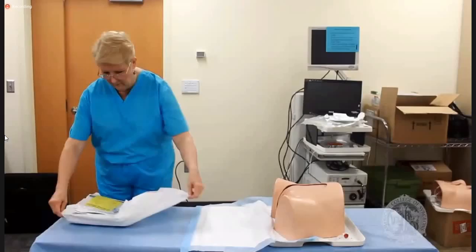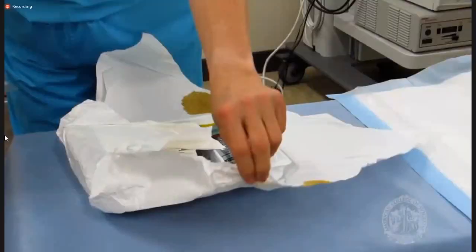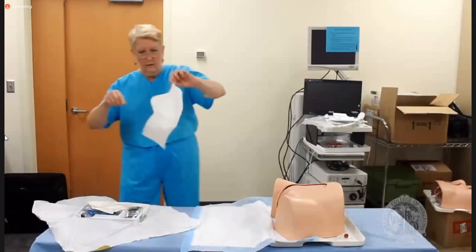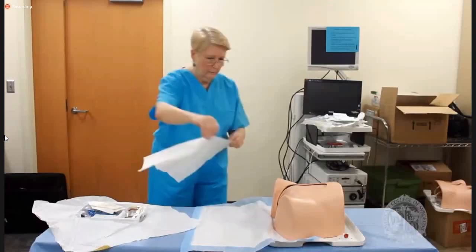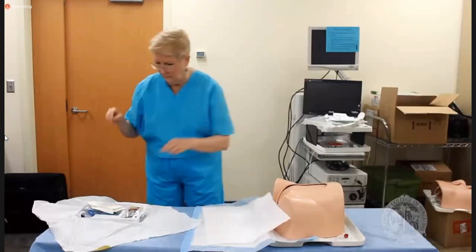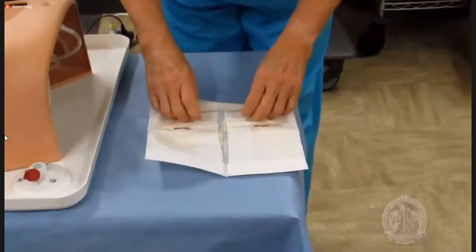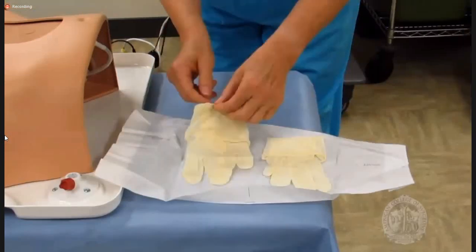Now that the perineum is washed, it's time to move to the sterile portion of the procedure. Make sure to place the sterile field in an easy-to-reach location that ergonomically works for you. You will be doing most of the work with your dominant hand, so that should be the side closer to the field. Place the sterile sheet under the patient, touching as little of the sterile part as possible. Don your sterile gloves like so, making sure you have nothing below your elbows such as a watch or ring.